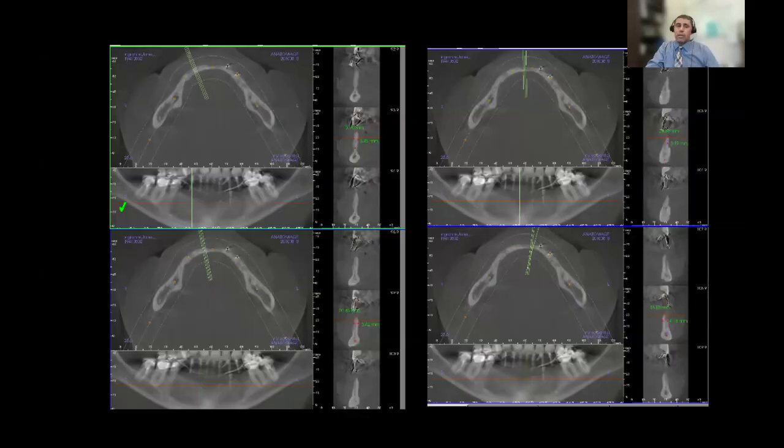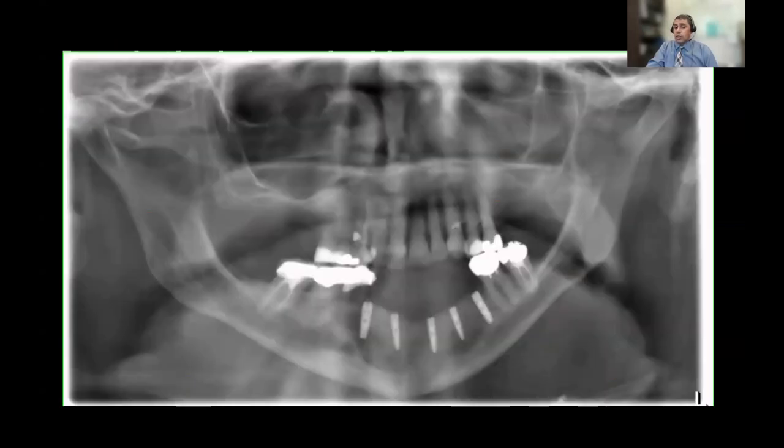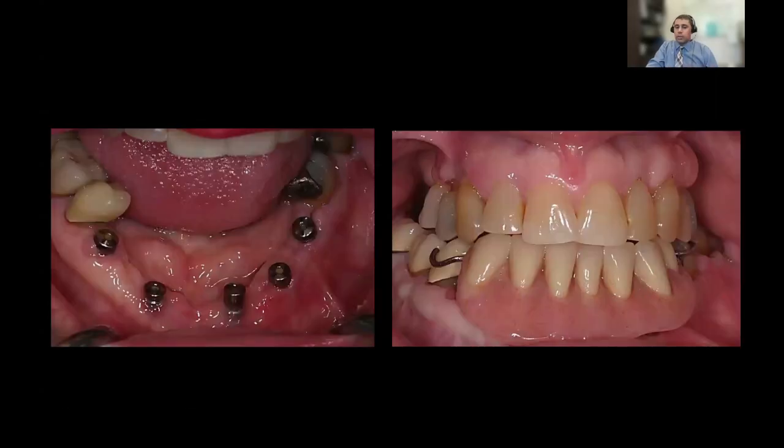remember the discussion about the implant to crown or crown to implant ratio here. It's going to be significant because of the amount of bone loss that Jane has. So here actually we maximize the number of implants that we're placing. So we placed 5 implants to replace 7 teeth, and certainly those will be splinted together. And so that's what we did here.